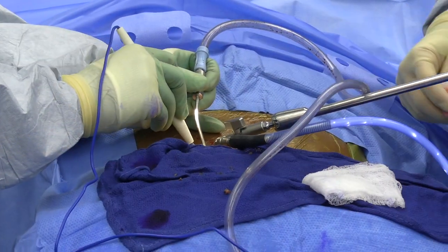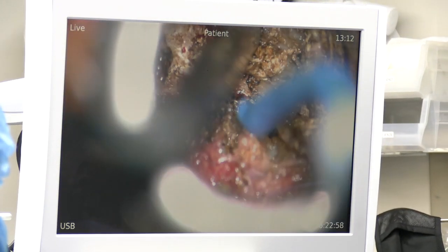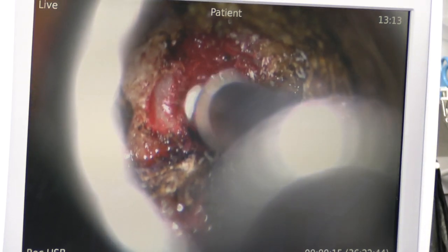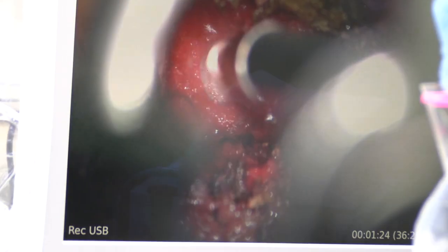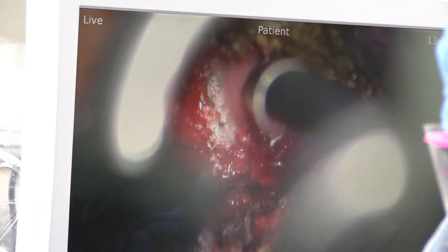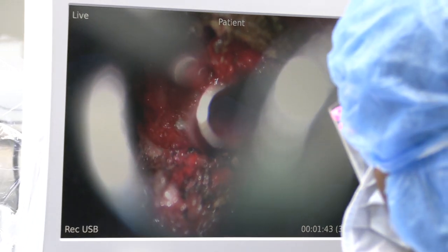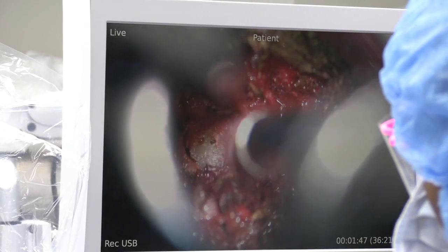That's the undersurface of the lamina of three, so now I work up from mid-pedicle to the level of the above, and that's what decompresses her. This is soft tissue. What I'll do is drill this lamina out to the spinous process. The ligamentum flavum right here is protecting me — it's between me and the dura — so that's the last thing we're going to take out, as it's the tissue that protects us when we do our work.